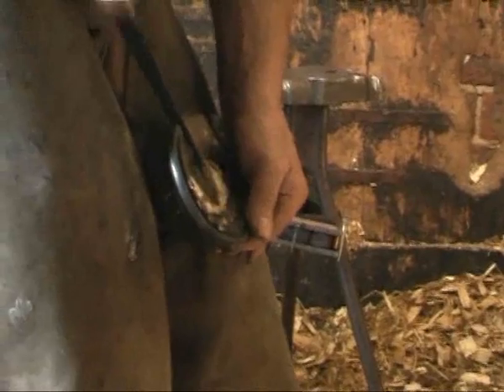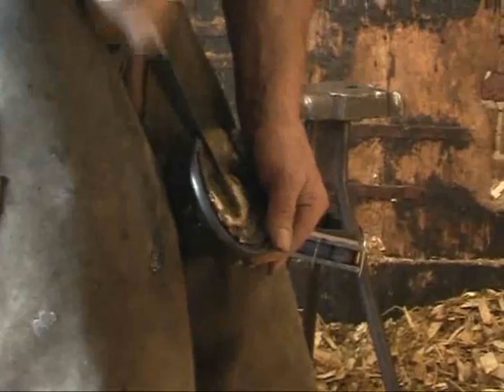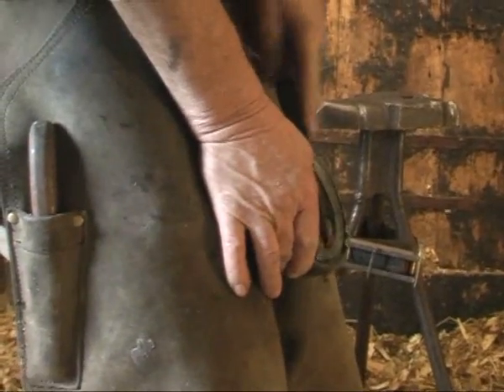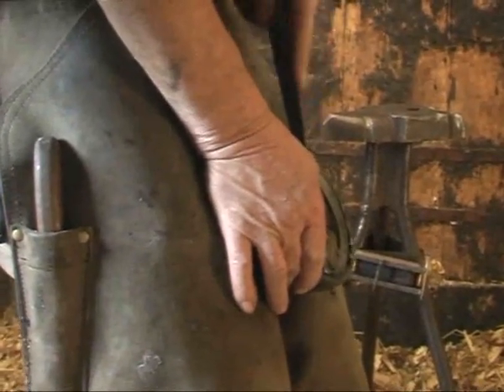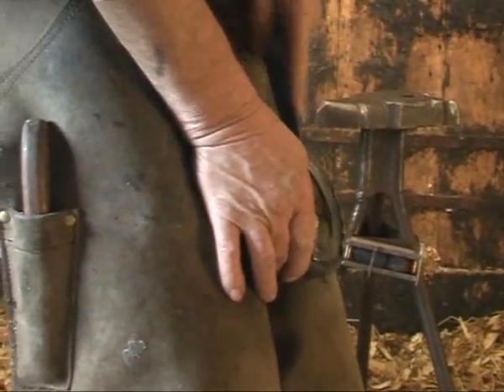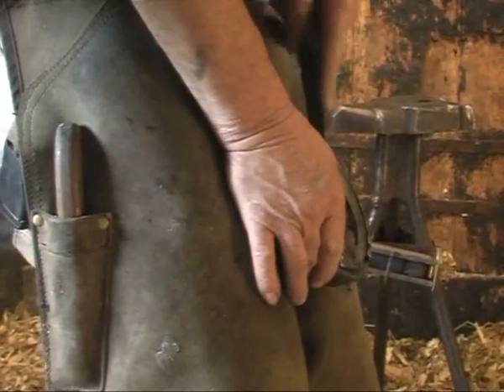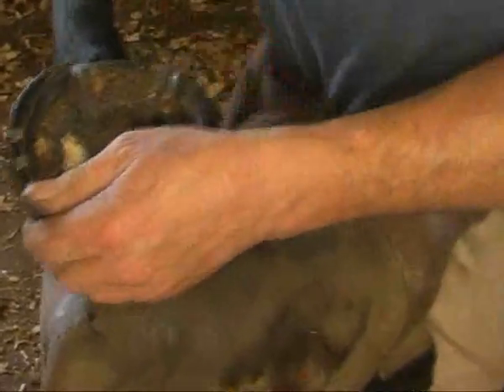This is the metal cutting hand saw provided by Equitec — part of the kit — and they fit in a Stanley knife handle. Once this thing has started to cut and you've got your initial groove, there's no problem. When you're trying to do it left-handed, it's difficult to get it to start cutting in. Remember, there's a quarter to three-eighths of an inch of bandage we've cut through on this heel — it seems like a long way when you're used to working on horses' feet. There it goes — that'll fall out now.